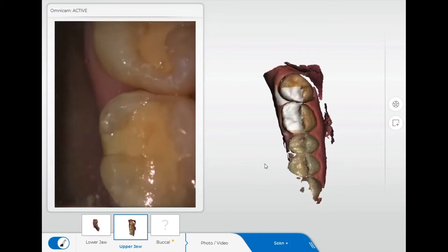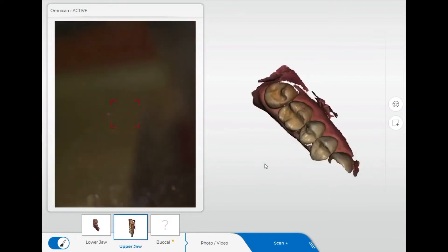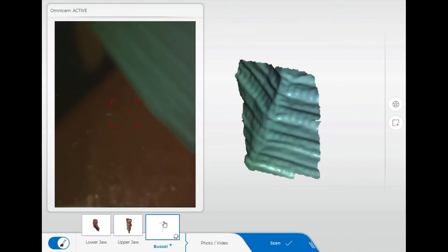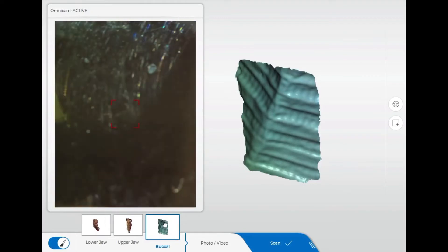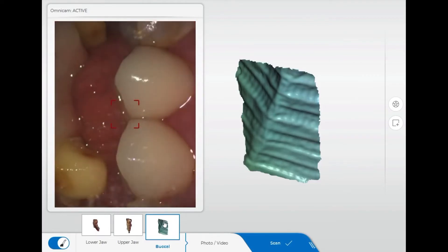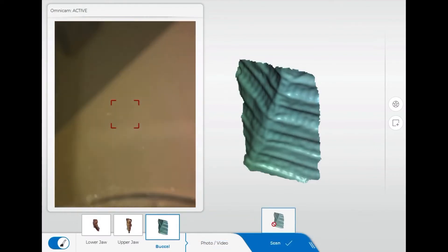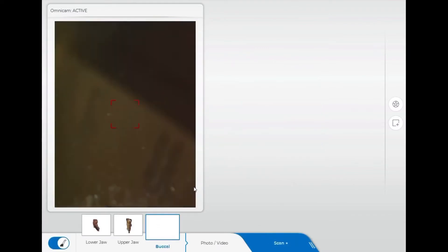One of the offices I'm partnering in has the newer Prime Scan, and I'm still getting used to the touch screen and trackpad versus the trackball. I'm not quite a fan of the Prime Scan yet, primarily because of that — I'm so used to the tactile feel of the trackball. But like most things, once I'm used to it I'm sure it'll be fine. I accidentally grabbed a piece of the patient's napkin while imaging and didn't realize it, so I had to go back, delete that scan, and re-scan. The rest of the design process is pretty straightforward.